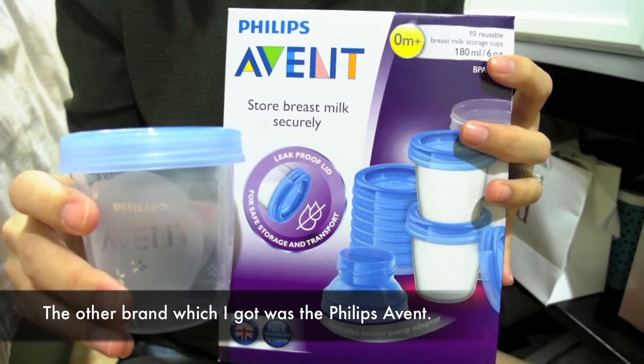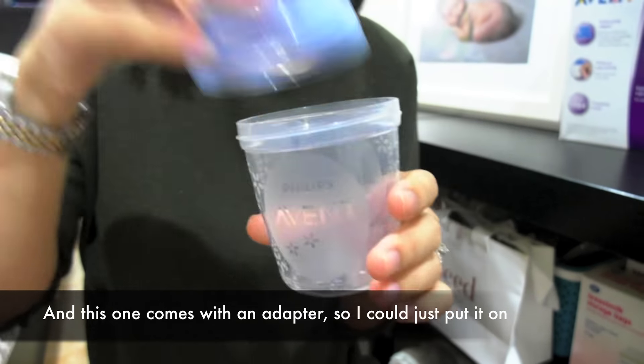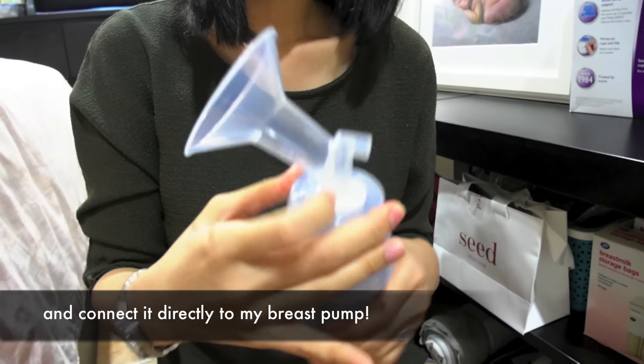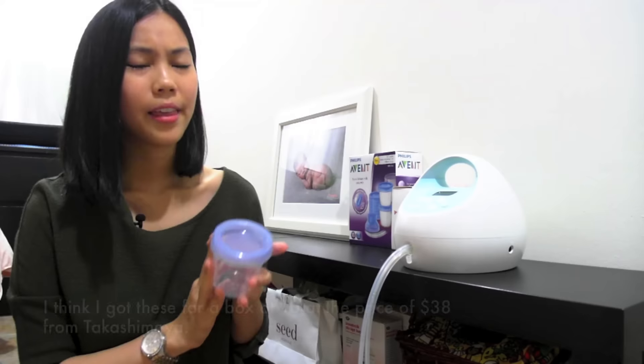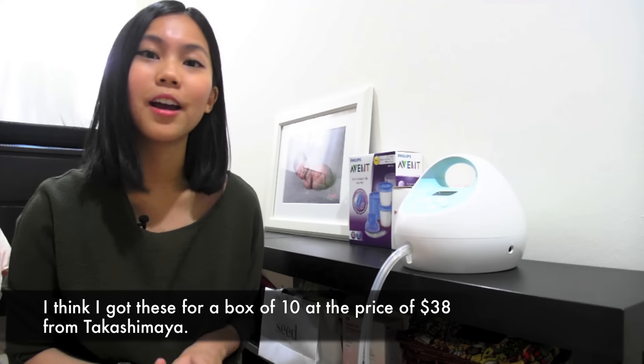The other brand which I got was the Philips Avent. These ones are bigger — they come up to 180ml. This one comes with an adapter so I could connect it directly to my breast pump. I got these for a box of 10 at the price of $38 from Takashimaya.